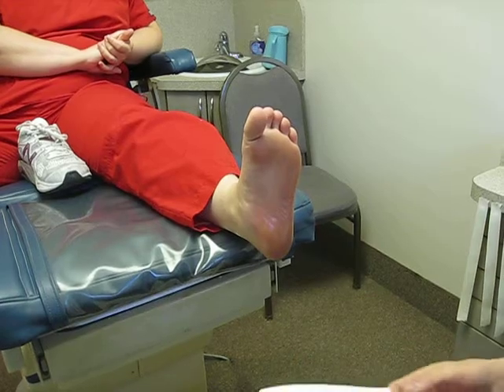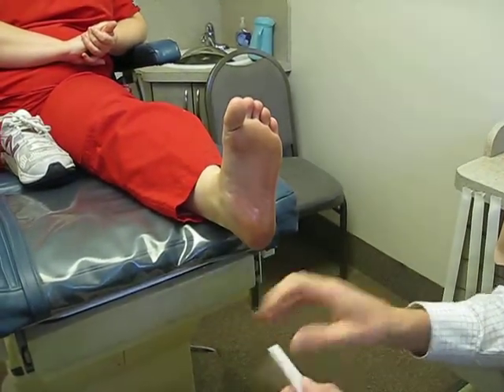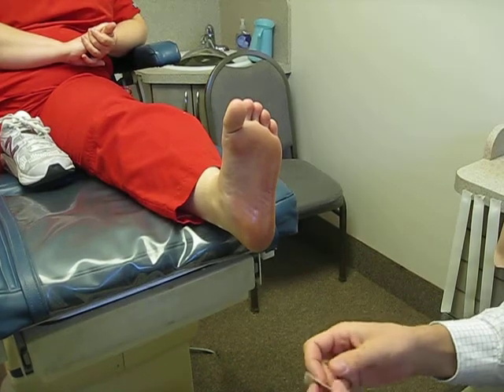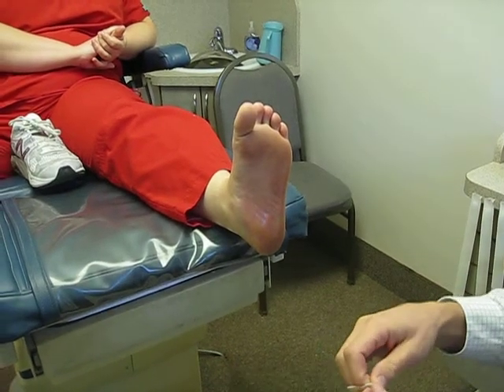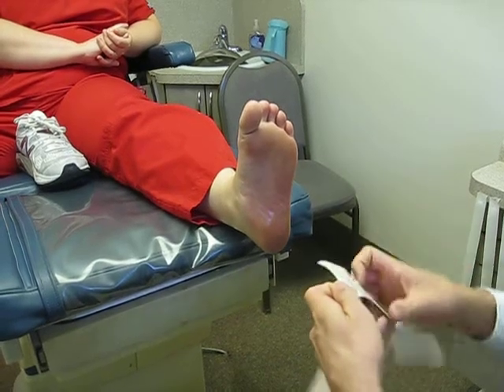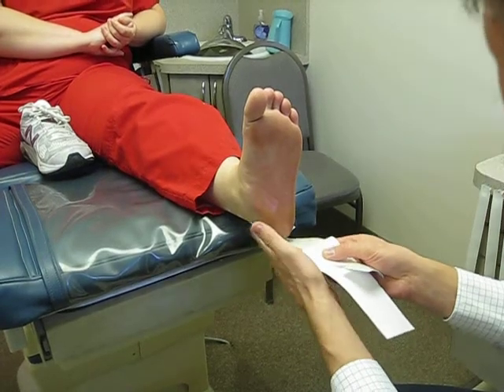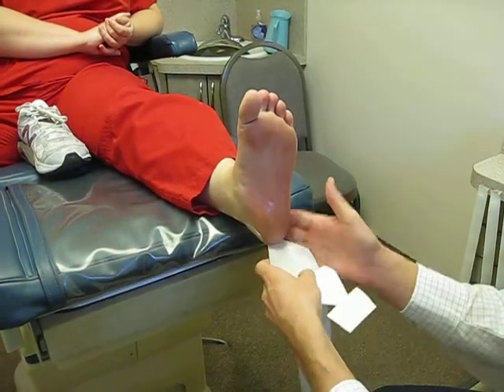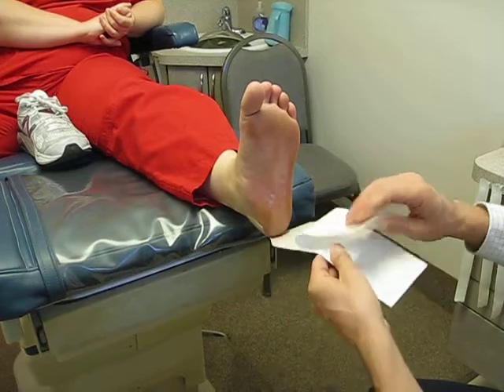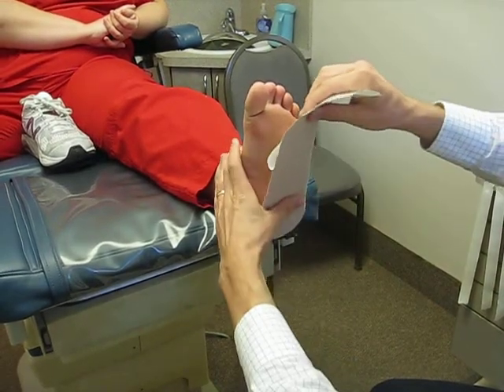The first layer is a plantar fascial strap — it's just Moleskin. You can buy this through Henry Schein or other sources. This is really the key to this method; it kind of holds everything together. You start by placing the tape just behind the heel and wrap it around throughout the whole process. Make sure everything lays very flat, otherwise you'll definitely get some irritation down the road.